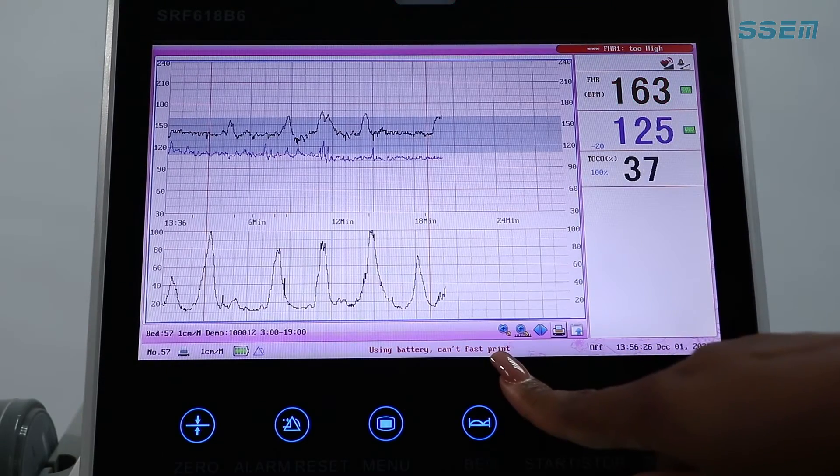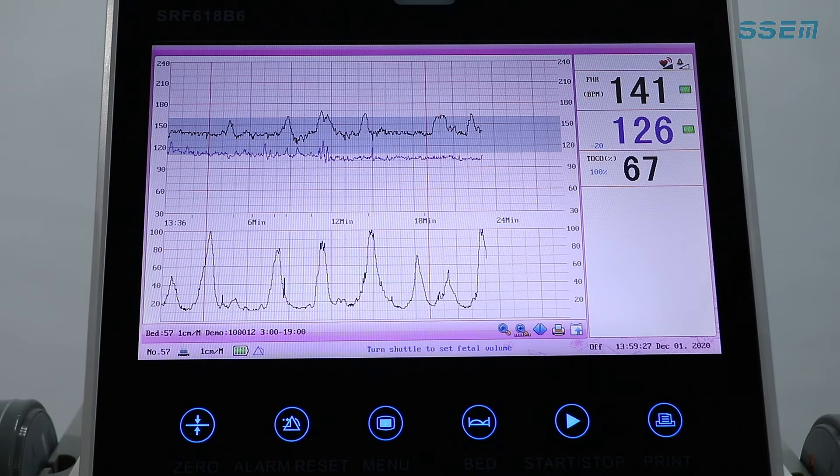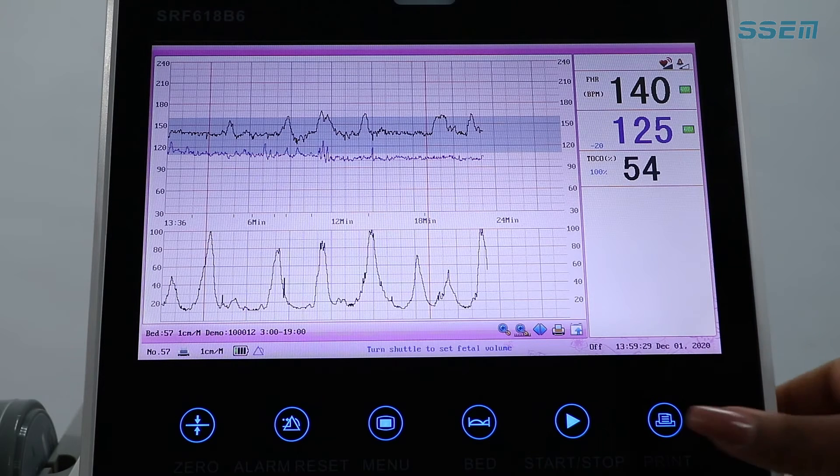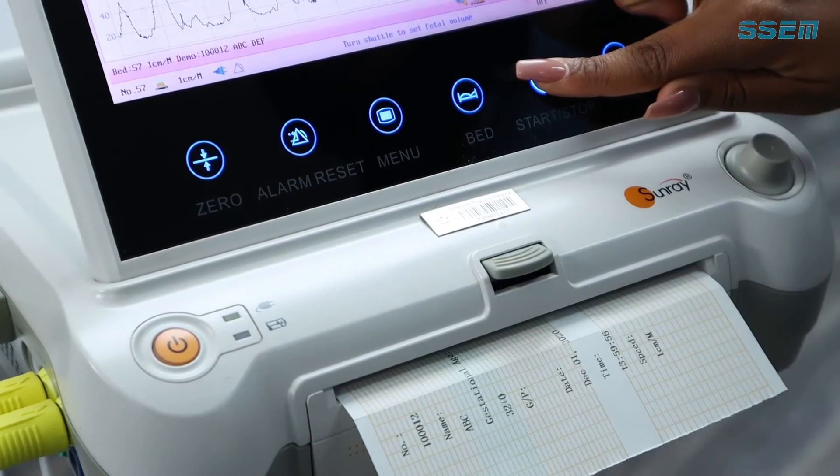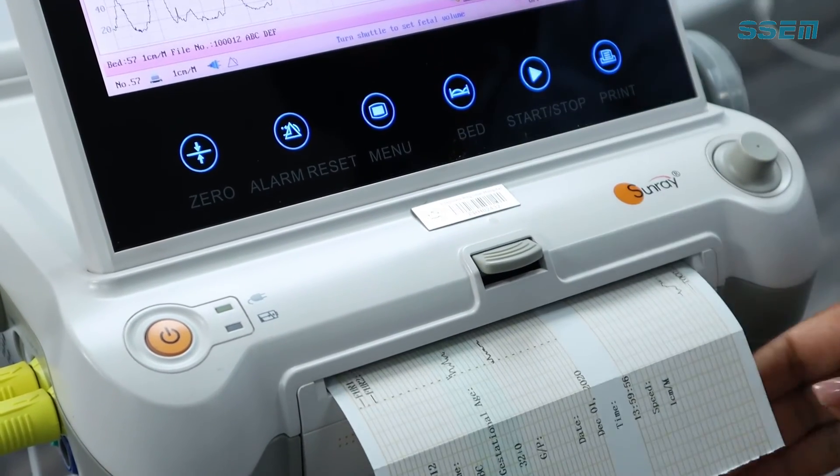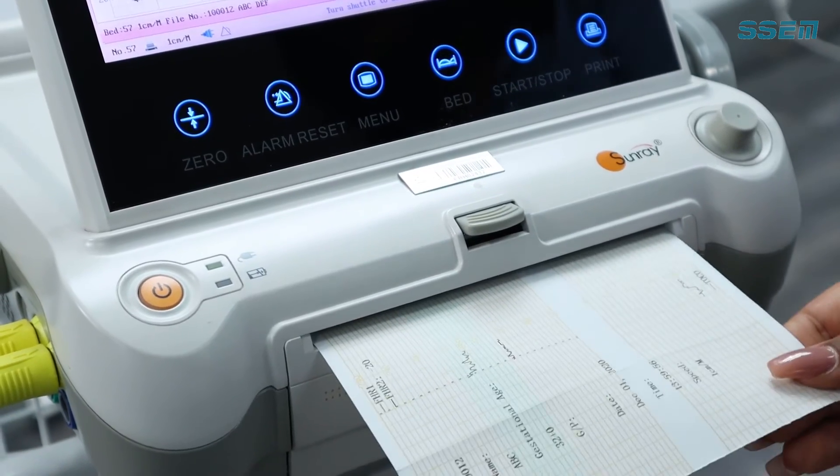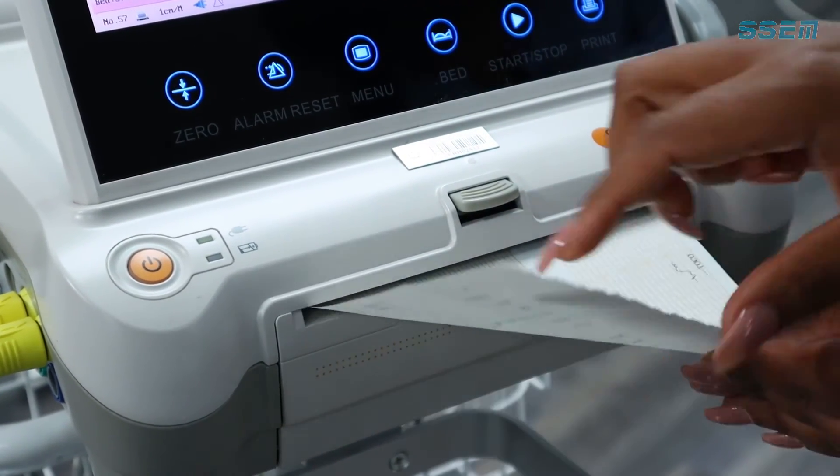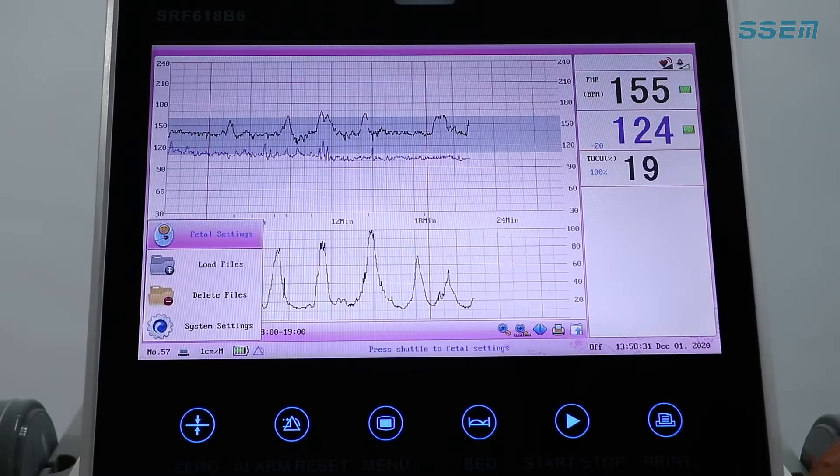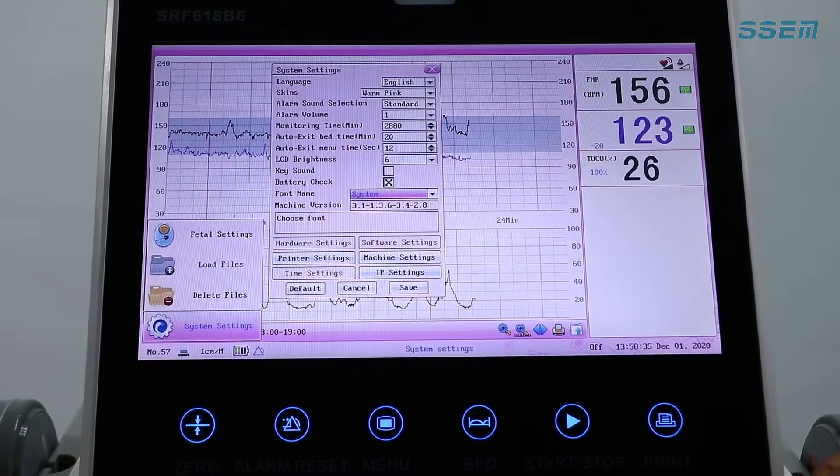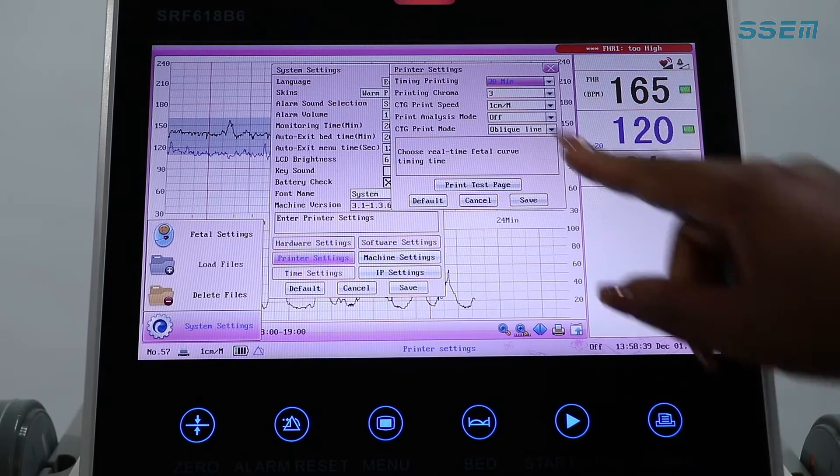The next method of print is a real-time printing. Press and hold the blue print icon. Note that this method of printing only prints from the time you press print and will stop when the stop is selected or the default printing time is reached. The length of this printout will depend on the default setting under printer settings.